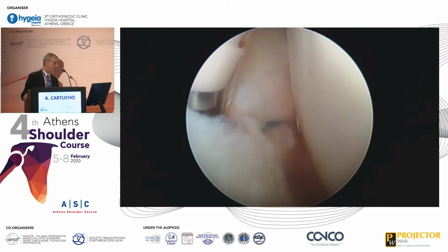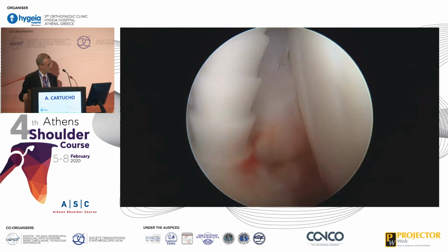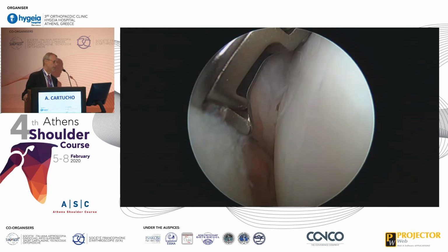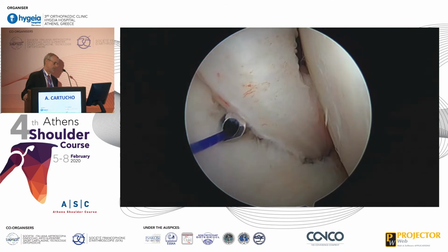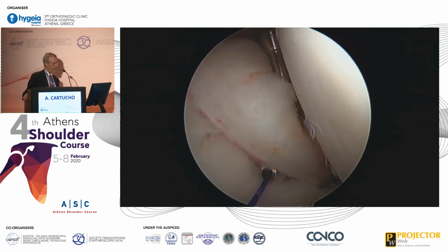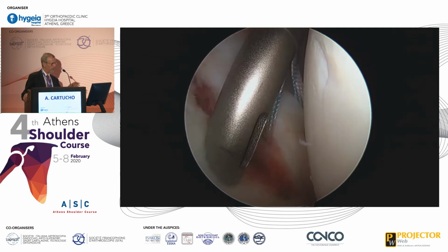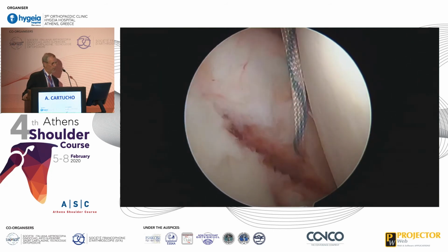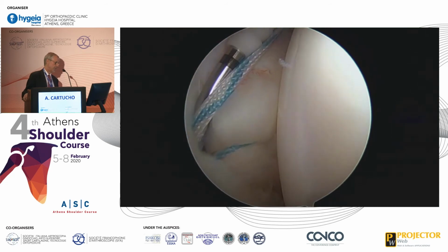As I told you before, my remplissage is already prepared, and after, when I do my labrum procedure, I will go back again to the remplissage, so I'll have to change my portals, and I'll have to go to my anterosuperior portal again. As you can see, I try to get, as you mostly do, a good bite of my labrum. I try to do a soft tissue bumper effect in order to have a good reduction of my labrum. And as you can see, I always like to have some blood flowing, because this is for me the idea that I have done a good liberation of my labrum, and I have biology in order to get healing of my labrum on the anterior part of the glenoid.